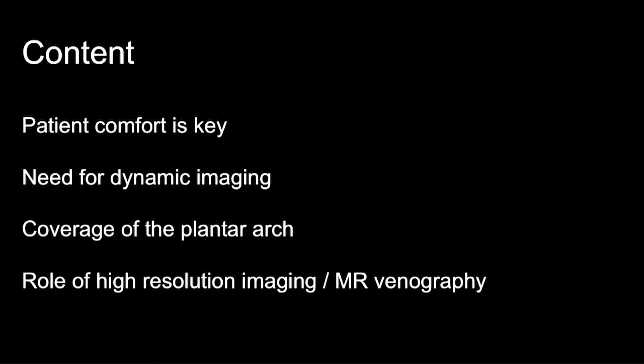So there are 4 points I would like anyone who's interested to take home from this talk today. One is that if you want to do good quality MRA, then patient comfort is key. 2, the need for dynamic imaging to avoid venous overlay. 3, the coverage of the plantar arch and why that's critically important. And 4, the role of high resolution imaging and MR venography.